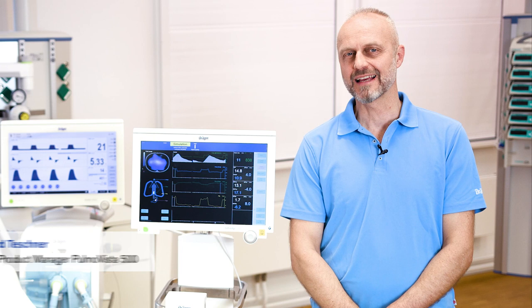Welcome to this tutorial which explains how to monitor esophageal and transpulmonary pressure with the Pumovista and the new Draeger pressure pot. Within the next minutes I will demonstrate how to prepare the measurements and how to control the correct position of the balloon catheter.